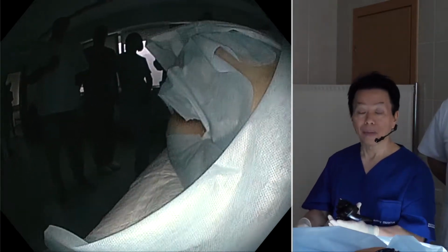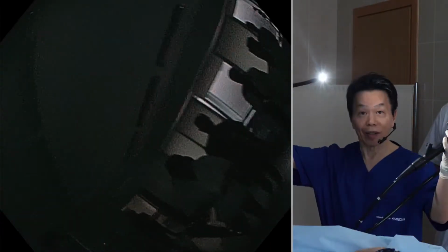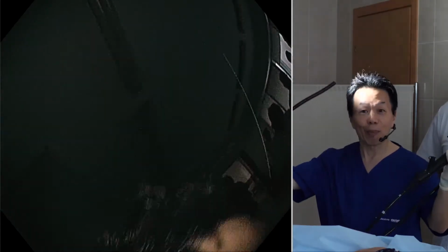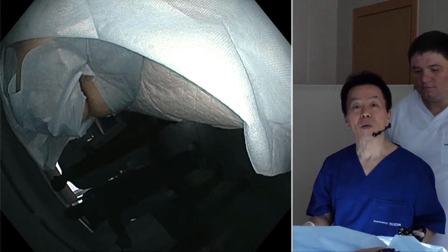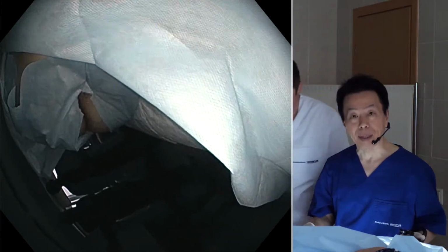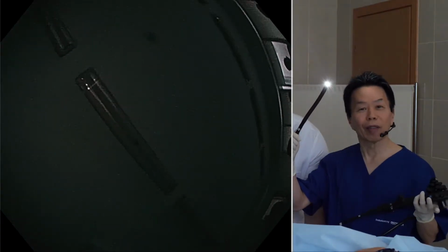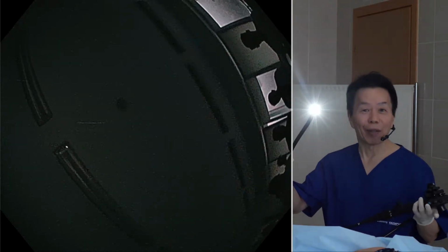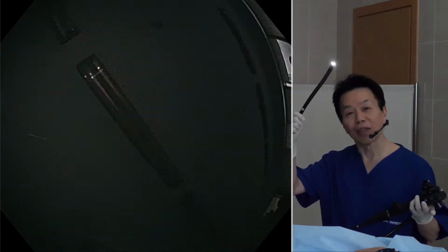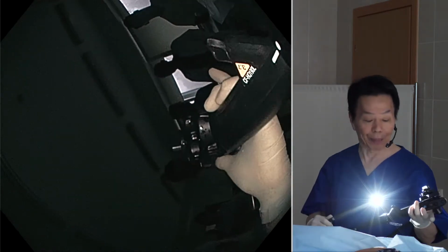And first, I must explain that I usually use an intermediate length scope. This is very long, but in Japan, we usually use an intermediate length scope that is 135 centimeters in length. I seldom use this long scope, only for obese persons or very fatty persons. Yes, and for very tall or very obese persons.